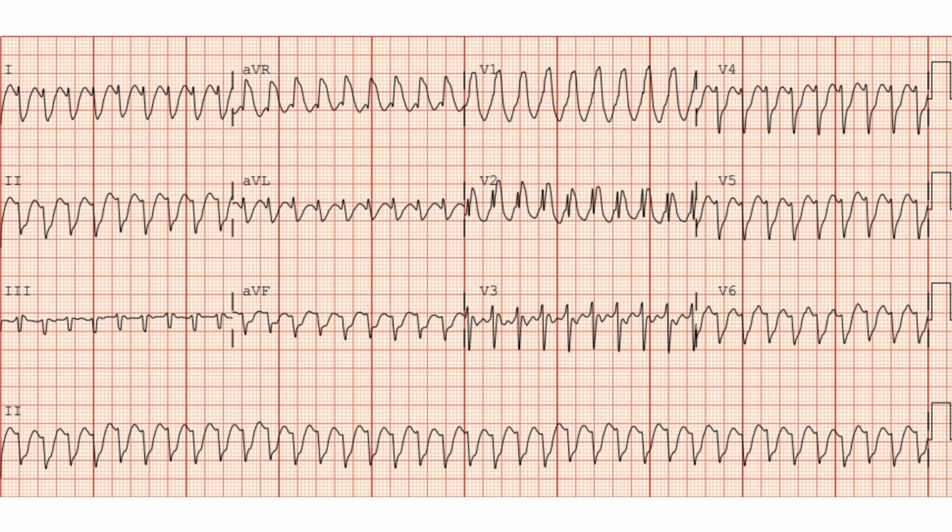He was still sedated from the propofol, so we tried 2 more times with electricity. Same thing would happen. He would convert for about 10 seconds and then go right back into the wide complex. So this is an interesting case and something I haven't had a lot, where electricity fails to cardiovert someone.